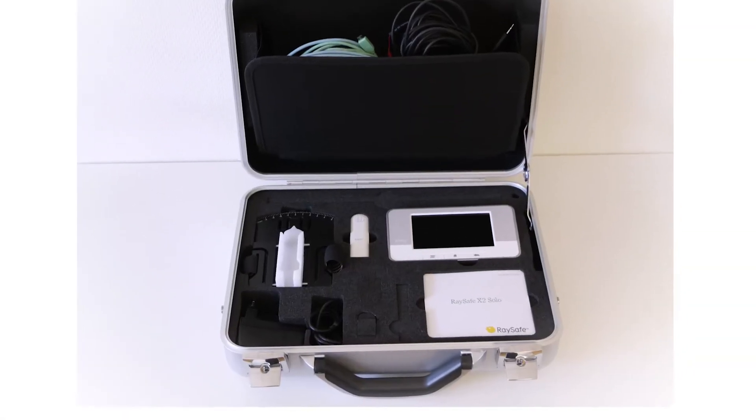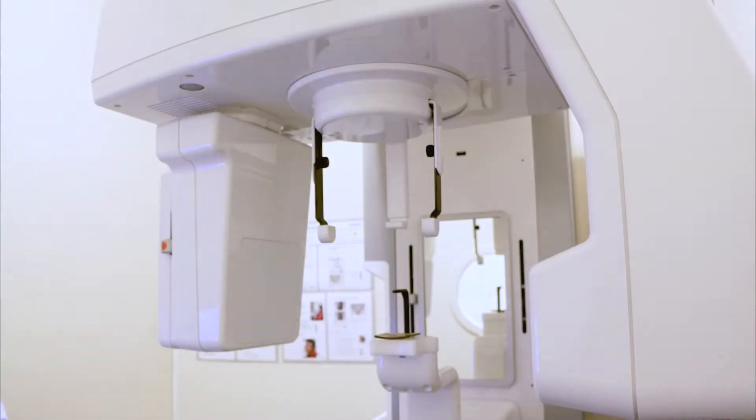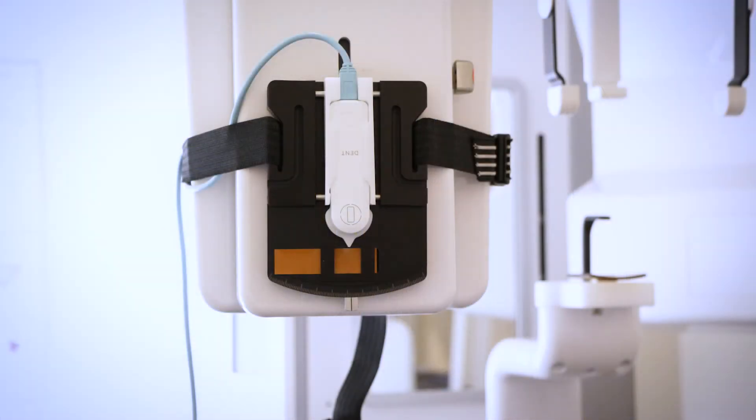In this video I will show you how to position a Raysafe X2 dental or RF sensor on a dental panoramic machine. The challenge here is to position the sensor in the exact center of the X-ray beam to get the maximum dose and correct HVL and KV readings. It can be difficult to know when the sensor is in the center before it's okay to start taking measurements.